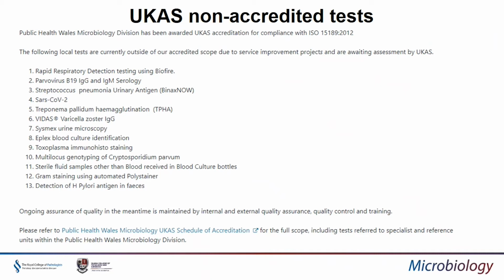Some of the things included in this are the Sysmex urine microscopy and the SARS-CoV-2 testing, because we had to implement a lot of those pretty sharpish due to the pandemic, and we've got multiple different ones around the network. Rapid respiratory detection using BioFire, and I think they're the ones I know for bacteriology that we've done. The other ones are going to be assessed in the next assessment, but we've got lots of new things coming in. So we'll likely have a lot more things being added to this list when they're live, to then get assessed by UKAS in the next visit.